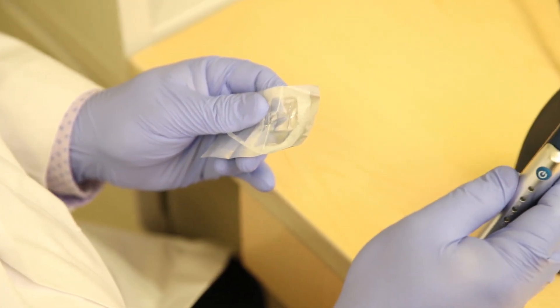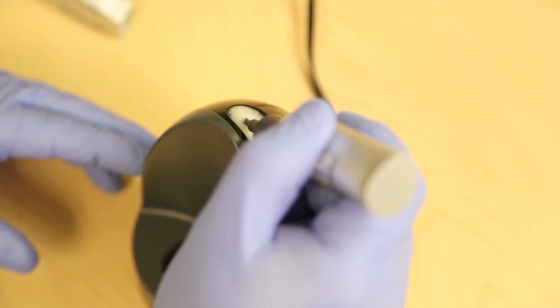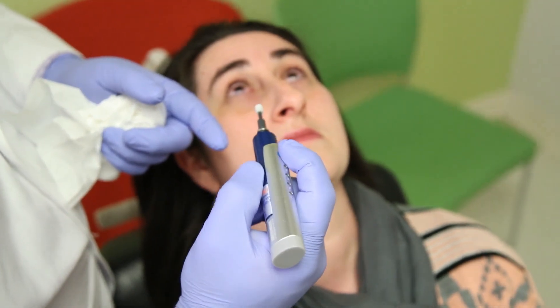Allow the patient to dab with a tissue and wait about one minute before beginning the procedure. Carefully load the sponge tip onto the AB Max handpiece and soak in the reservoir for 10 to 15 seconds. Press and hold the power button on the handpiece for several seconds. The tip will begin to rotate in a forward motion and the green F light will illuminate.